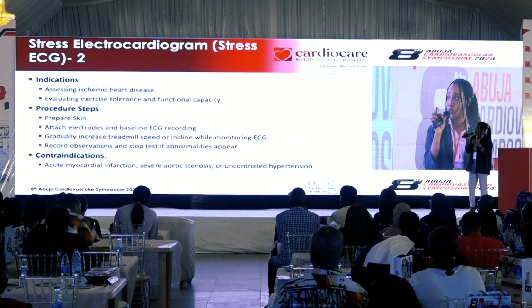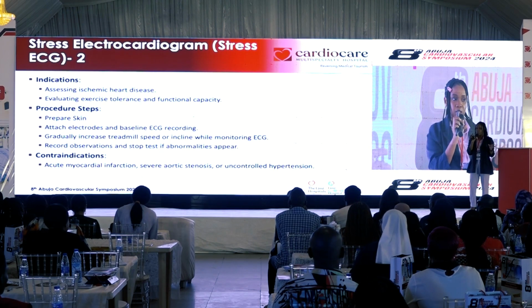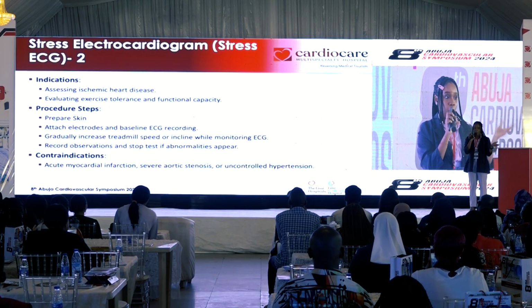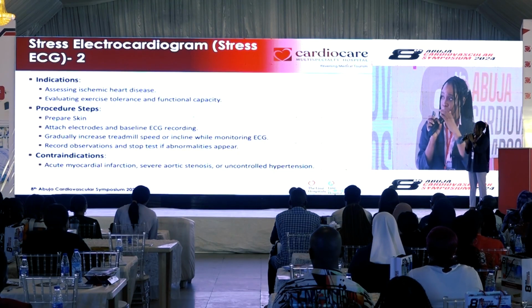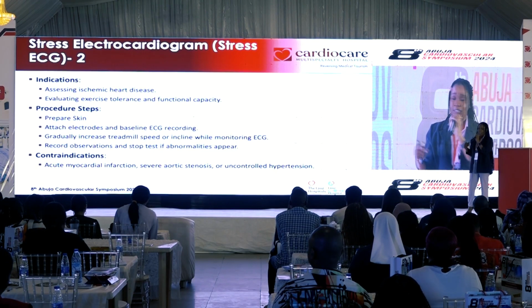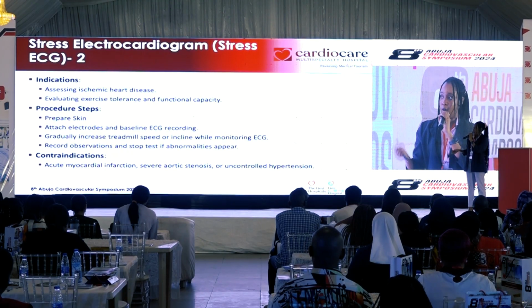So after that's done, preparing the skin, we attach the electrodes, but before that we do a baseline ECG. Doing a baseline ECG is very important, because when you want to report distress, you have to compare the resting and the stressed ECG. Okay, so we now attach the electrodes, then we gradually elevate this. After every 3 minutes it gets faster, and after every 3 minutes it inclines.